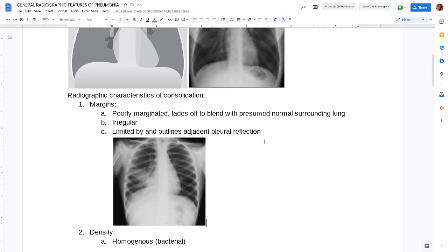There's a medical term that we use, especially in radiology, we call it consolidation. It has consolidated. It has hardened, and its ability to absorb the X-rays has increased. So there are less X-rays actually passing through that area, and on the image, it will look white.